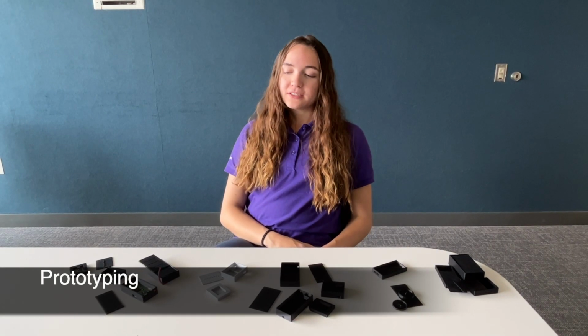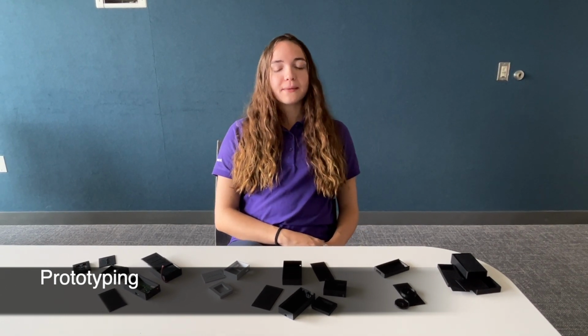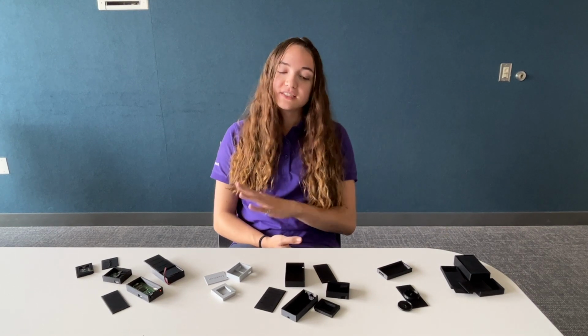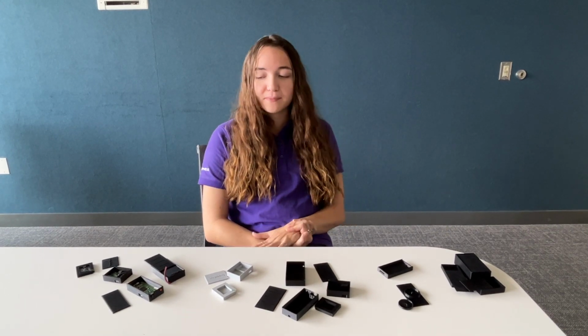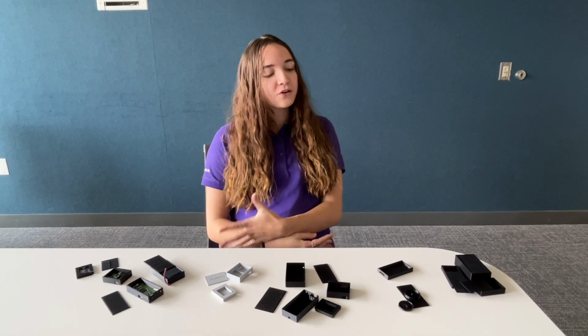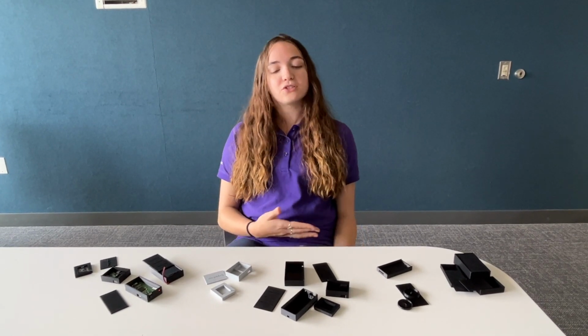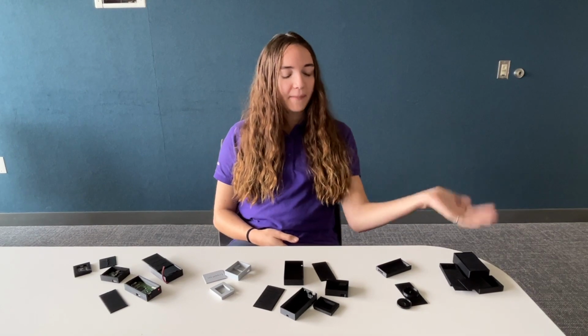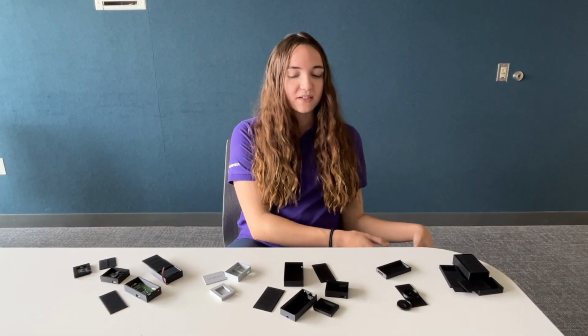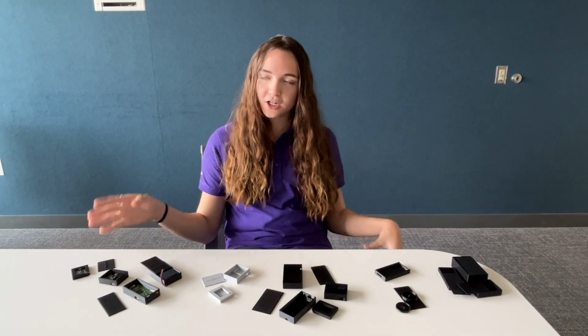Going a little bit into the evolution of our prototyping and the housing for our Snorpheus system. We have laid out in front of us just some of the 3D prints that have been made in terms of testing, sizing, fitting, and going over different options for what we want Snorpheus to look like. Going from my left to my right, we have the oldest, most basic models all the way up to the newest ones that we are currently using.